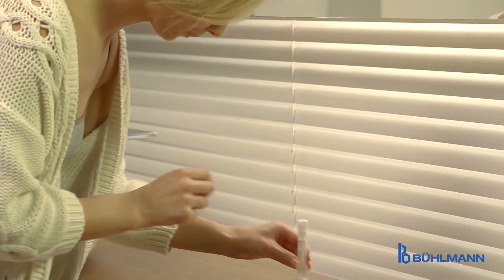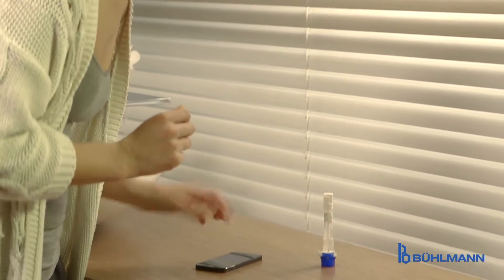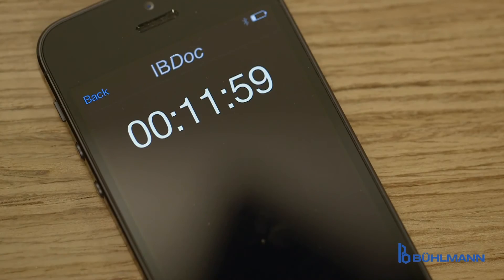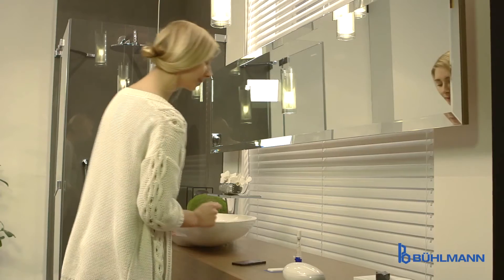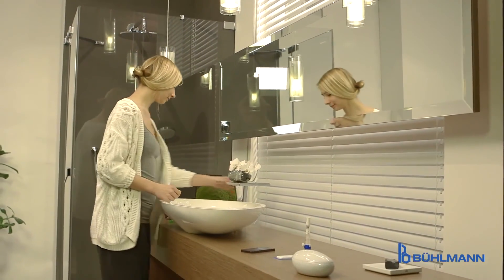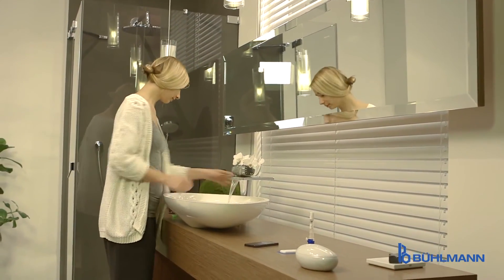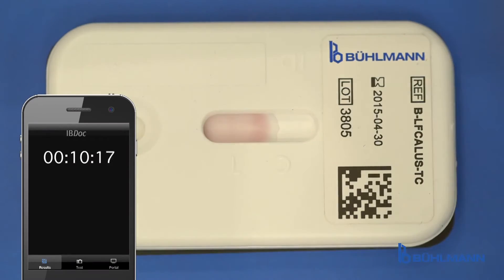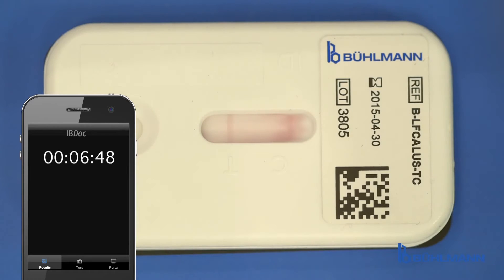The timer in the IBDoc app is activated — now the reaction runs. During the following 12 minutes, the patient is free to spend the time the way he wants until the beep of the app timer signals the end of the test run.